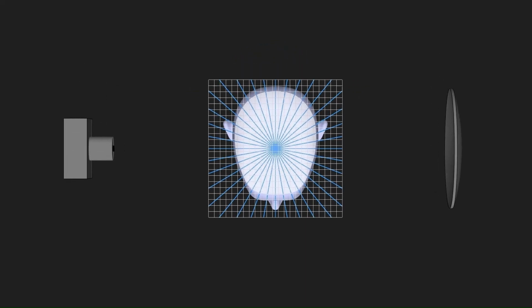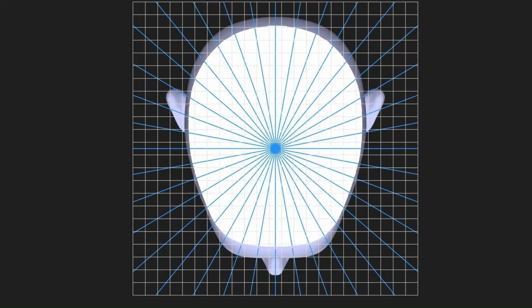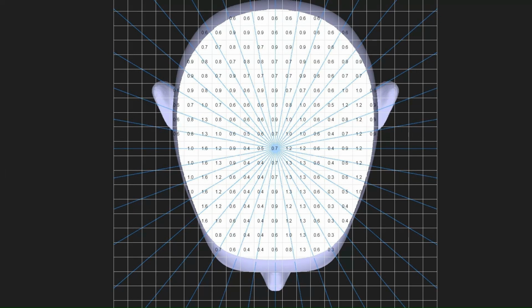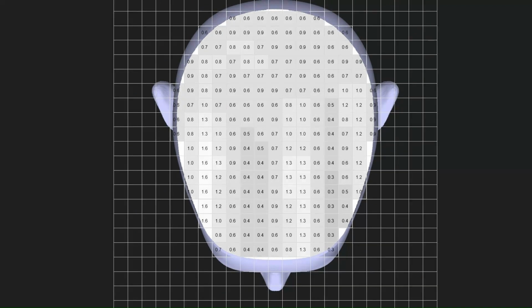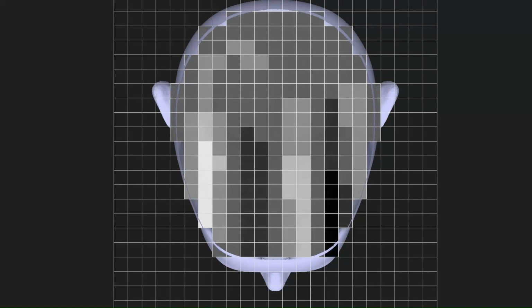The data from all the slices is processed by our proprietary algorithm to create the 3D pCT image. Each voxel, that is 1 millimeter cube, is assigned a number. This number reflects how much the tissue in that voxel tends to slow down a fast-moving proton. Just as with conventional CT, these numbers can be converted into a grayscale image.